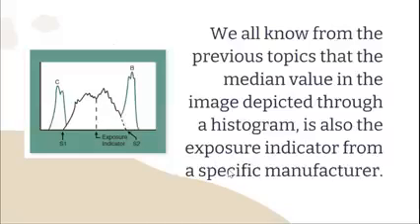Okay? For each manufacturer, a target median pixel value, which represents the ideal amount of exposure at the detectors, is set at the center point of the exposure indicator scale. Okay? So di ba previously gimension naman po na kung saan nasa middle sa histogram mo siyang exposure indicator and is the ideal exposure for that specific machine na i-provide sa specific manufacturer.